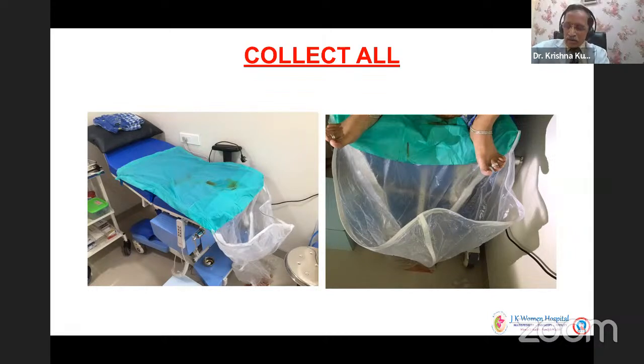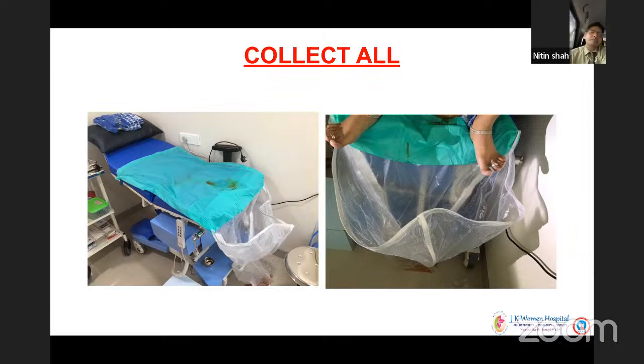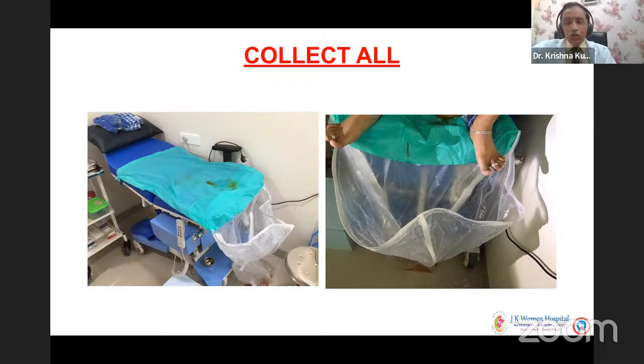So today I think we should not talk about glycine. Those old timers who have continued to use it, fine, but the beginners may not use glycine. That's what I would try to tell. You are a very senior person, a pioneer who has taught all of us, so that's fine. So let us go back from glycine now.